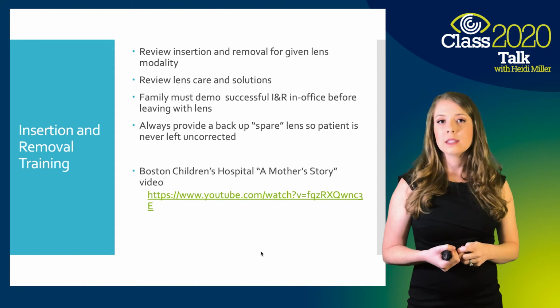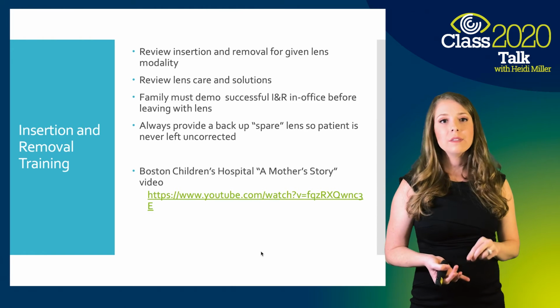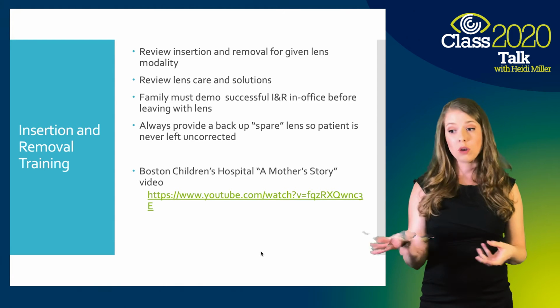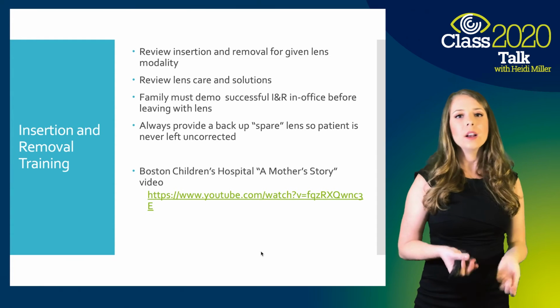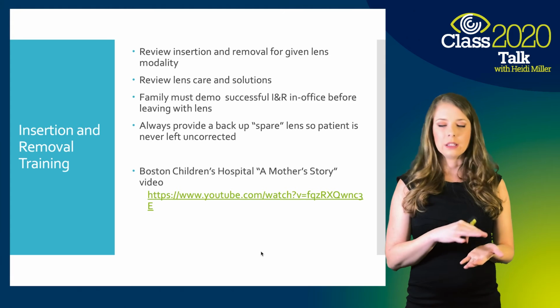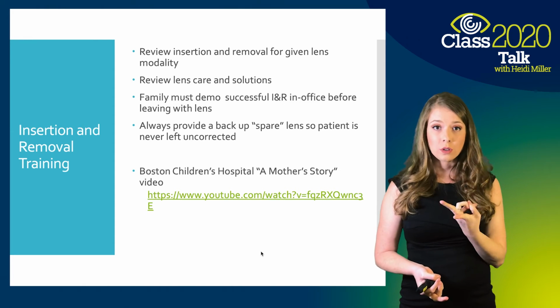For me, if I'm doing a SilSoft lens, I like to recommend ClearCare, but I also give them a multi-purpose like OptiFree. The reason for that is I like the ClearCare done every night for a really good disinfection, but when they're inserting the lens, sometimes the lens gets dropped somewhere or the patient flicks their mom's arm and the lens goes flying. And I don't want them to panic and say, oh my gosh, it fell on the ground and all I have is ClearCare. So I want them to be able to clean with the multi-purpose really well, get any lint off of that contact lens, really disinfect that lens, and then go back to doing insertion. So I give the recommendation of those two.